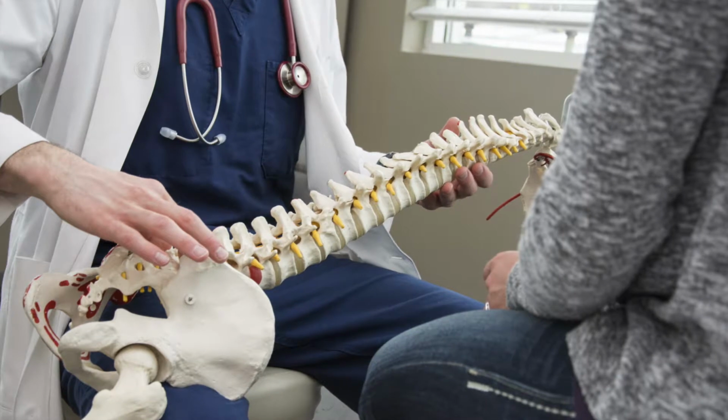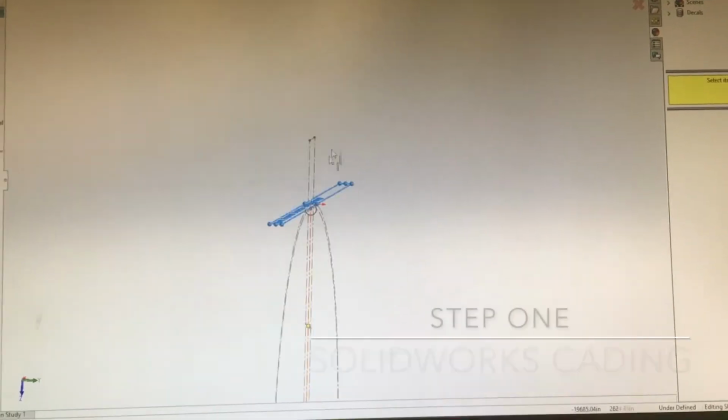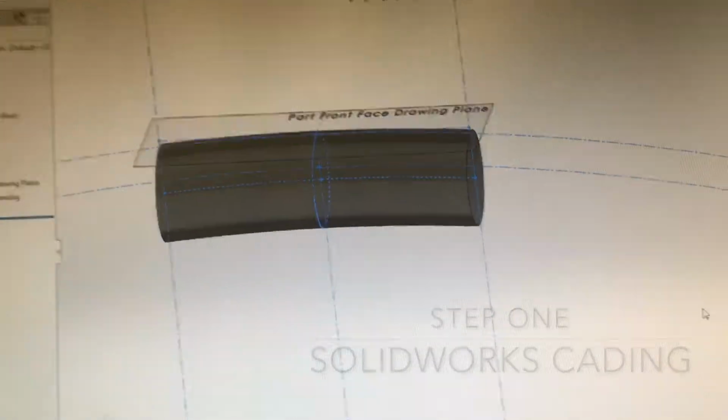This cervical spine implant is used to decompress and stabilize the spinal structure. Let's get started with the manufacturing process. First, we begin by making the CAD file for the implant in SolidWorks.